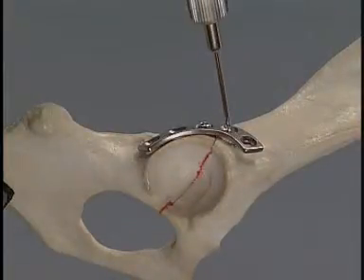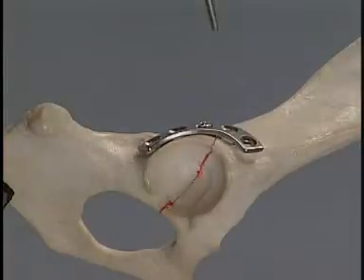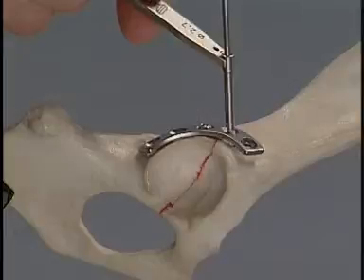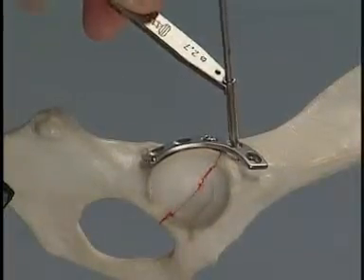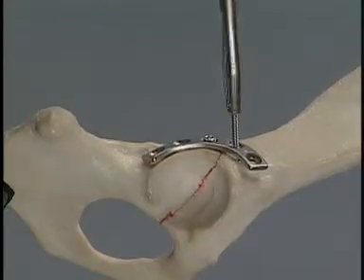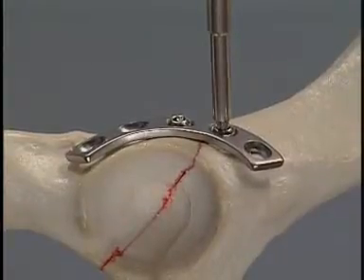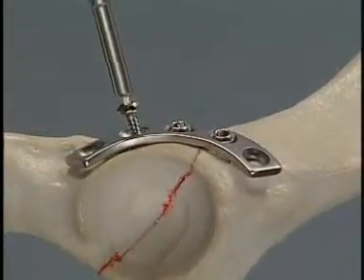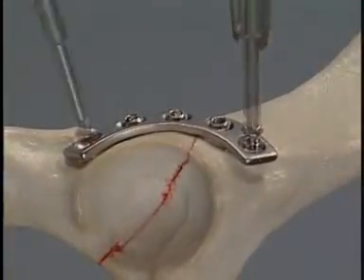Measure the depth of the hole. Cut the thread. Insert the appropriate 2.7mm screw. The remaining screws are inserted in the same manner using the green neutral drill guide.